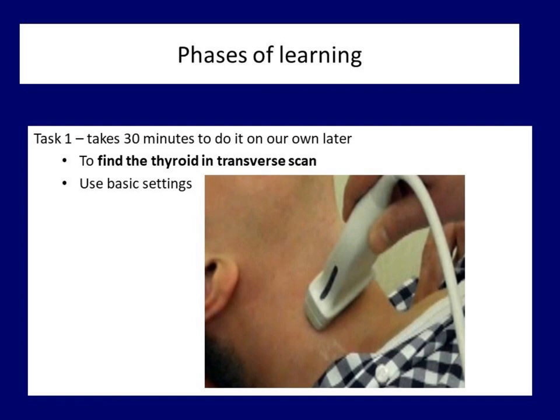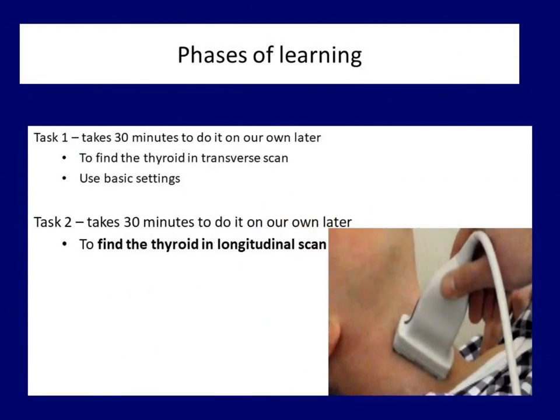Let me ask you to examine first only the right lobe of the thyroid. The next step is to find the thyroid in longitudinal scan when the transducer is parallel with the patient's neck — again, examine only the right lobe. It is more difficult to examine a patient in longitudinal scan than in transverse view, and learning longitudinal scan requires the ability of transverse scanning. So don't hurry — don't save time for the first phase. If you follow this suggestion, 30 minutes will suffice to learn longitudinal scanning.